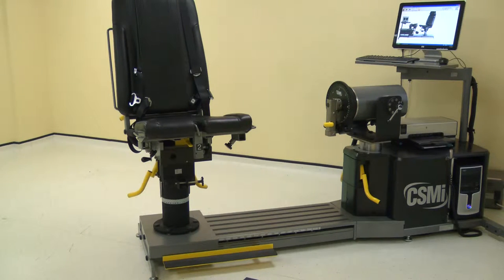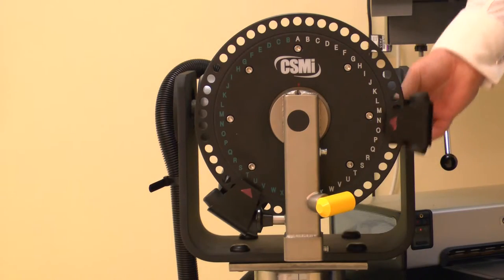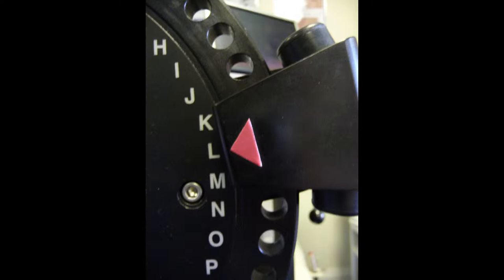First ensure all of the adapters and stabilizers are removed. Move the first dynamometer stop to position L on the wide scale. Now move the second stop to position X on the wide scale.